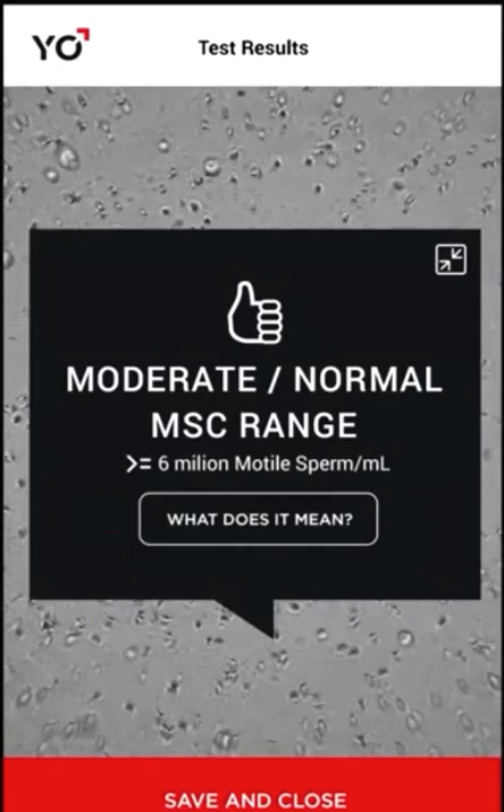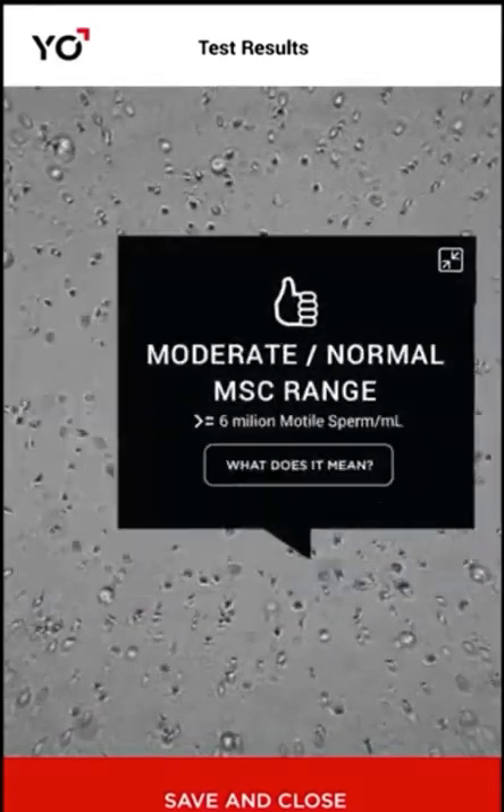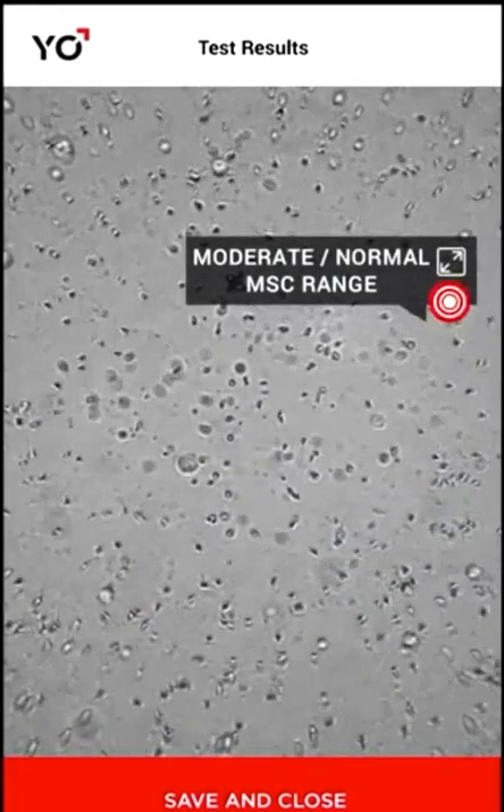View your swimmers in action. To see your sperm in full screen, tap the minimize button. To enlarge your sperm, stretch your screen.